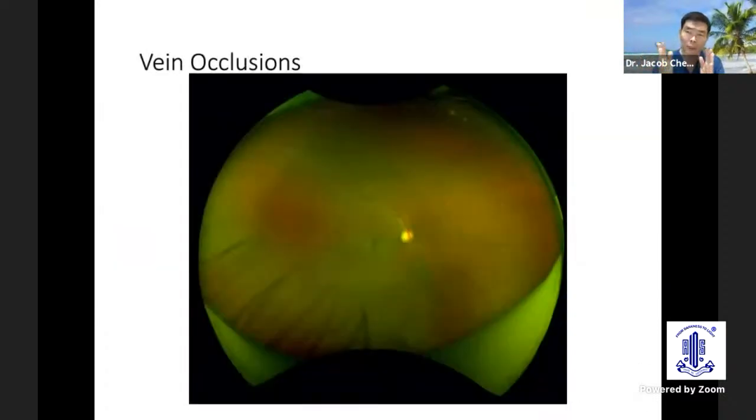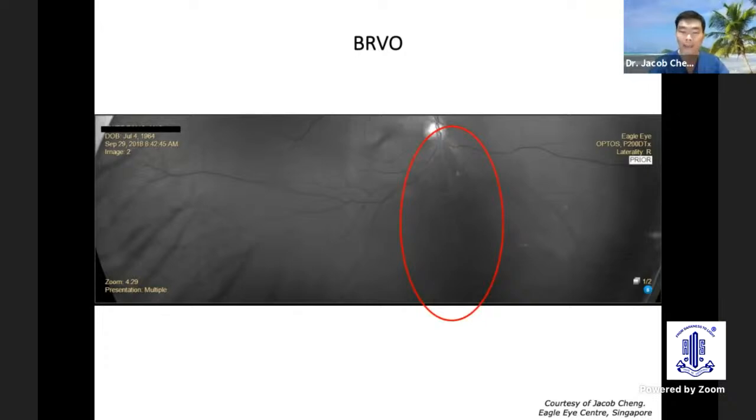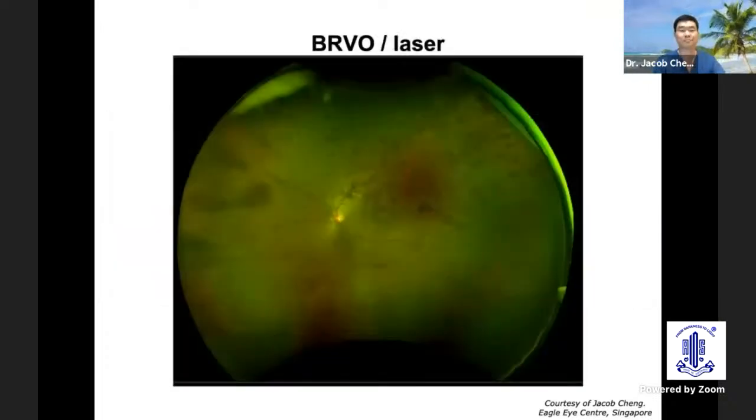But looking beyond the patient complaint of the left eye, we image the right side as well routinely. Here, what do we see? Almost normal looking retina, but you might just spot a sclerosed vessel inferiorly. So zooming in, you can see there's a sclerosed vessel inferiorly in this asymmetric right eye. You can also see the darkening supplied by this retinal vessel. This wedge-shaped distribution will be manifested, enhanced, and highlighted on the green channel, as you can see here, where it highlights the retinal pathology better.